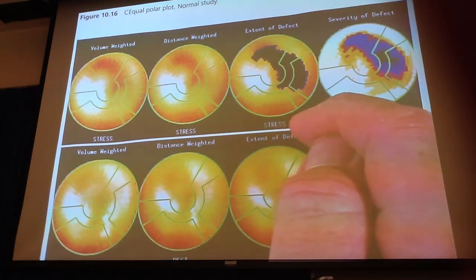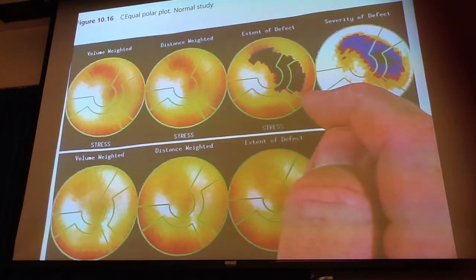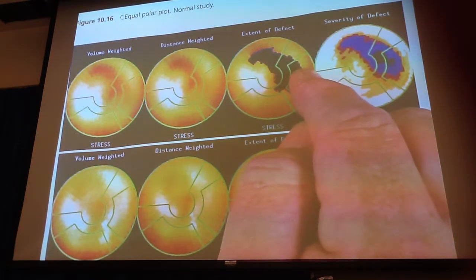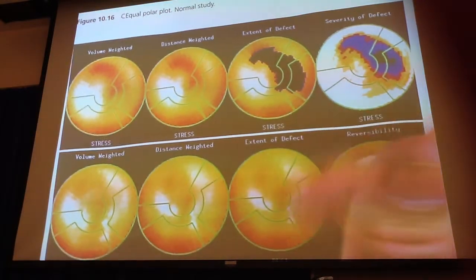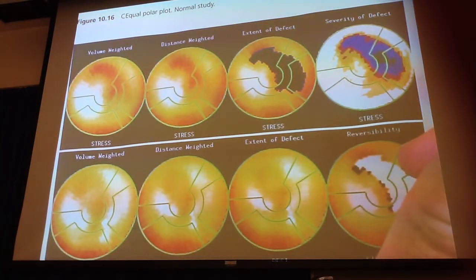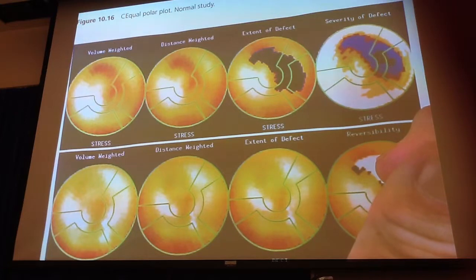Left anterior descending, and what else do we have involved there? Circumflex, so circumflex, left anterior descending, right coronary artery looks okay, but it fills in. Okay, so I'll have our expert on myocardial ischemia tell us what is wrong with this patient.